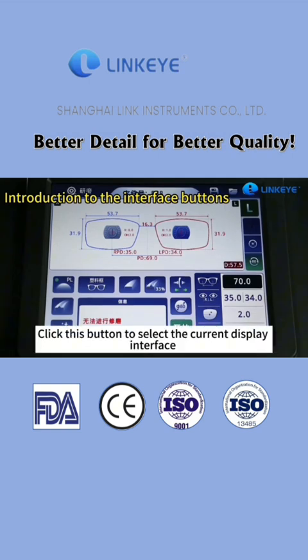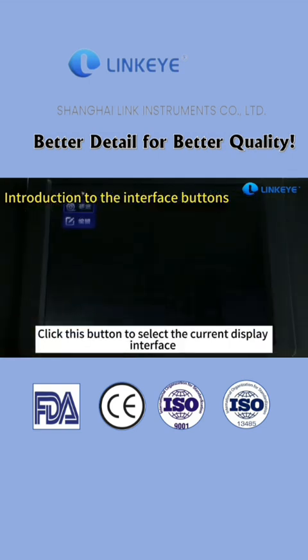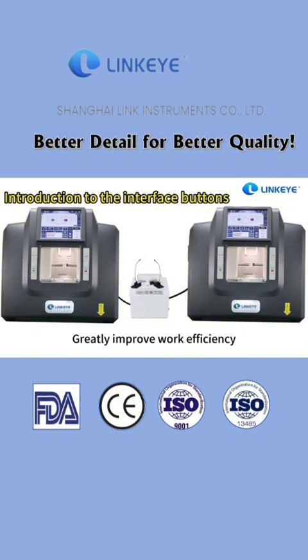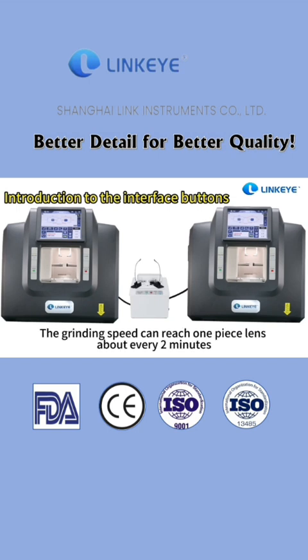Interface selection button. Click this button to select the current display interface. You can select the connection mode 1 or 2, greatly improving work efficiency. The servo motor can work for a long time. The grinding speed can reach 1 lens about every 2 minutes.